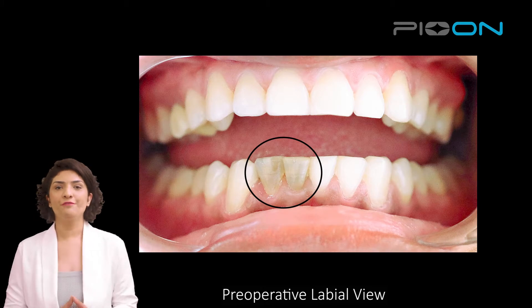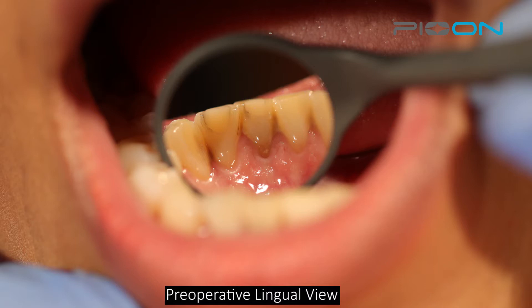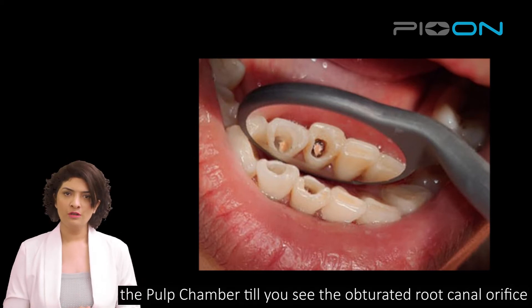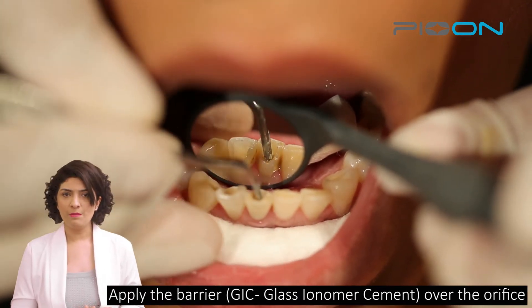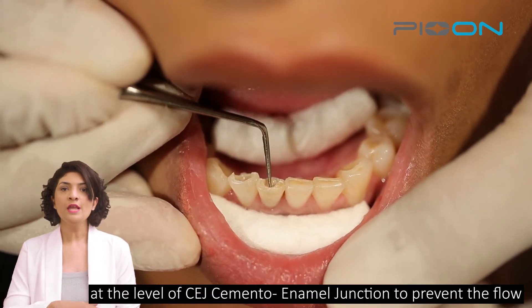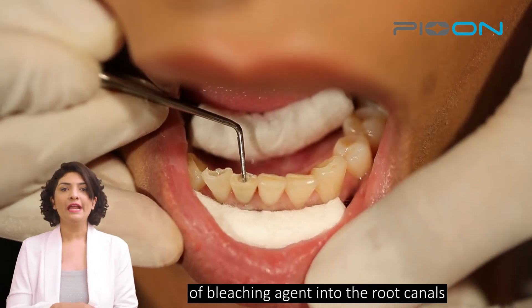Here is the pre-operative view of the case. First, we have to remove the old restoration and then place a layer of GIC, which is glass ionomer cement, as a barrier over the orifice and the GP so as to block the reach of bleaching agent into the canals.